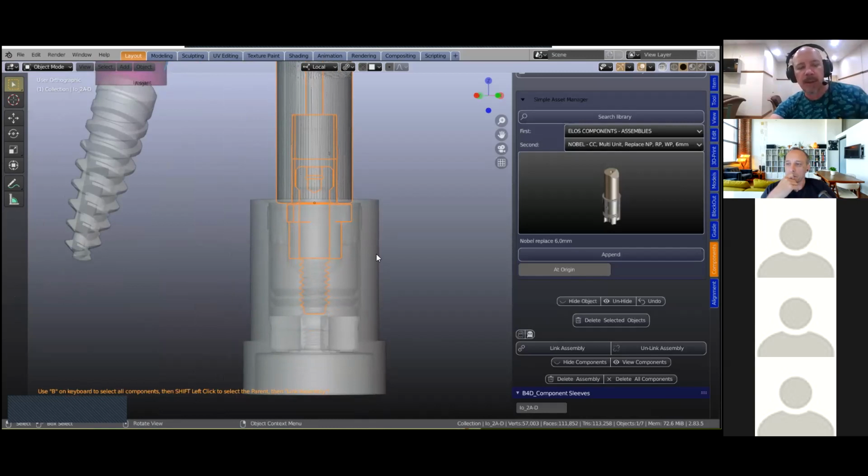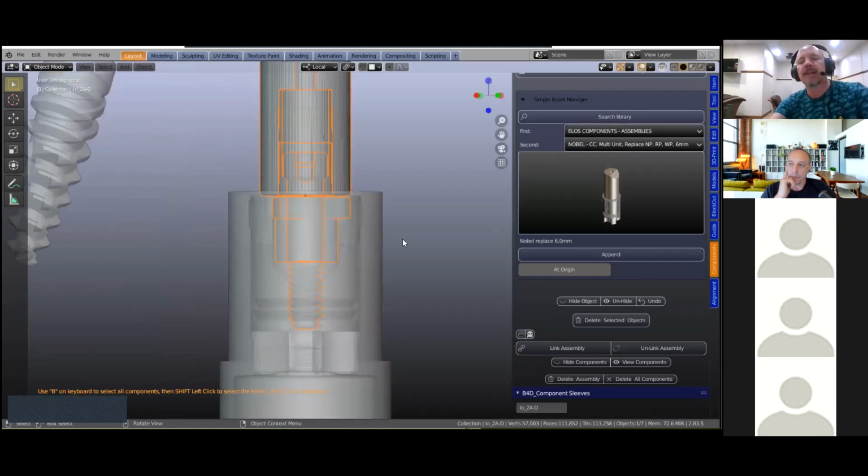But Medentica, we will have them, and I think Wolfgang, is it Odontofix or Yenadent? Yenadent has some, yeah. So it's still growing, and hopefully we'll get all the components. I don't know if we can, but Wolfgang, you're going to be working overnight. Well, the majority of them, I guess, the leading companies of the world.